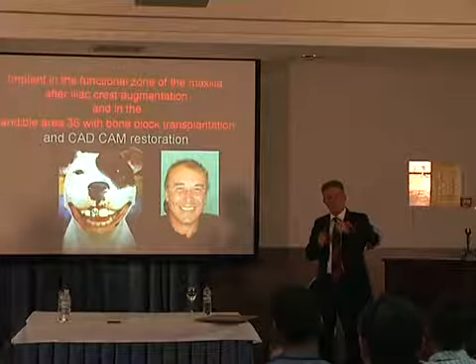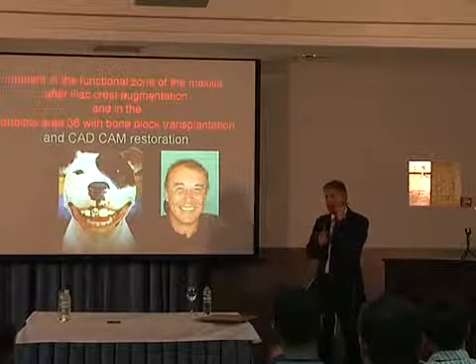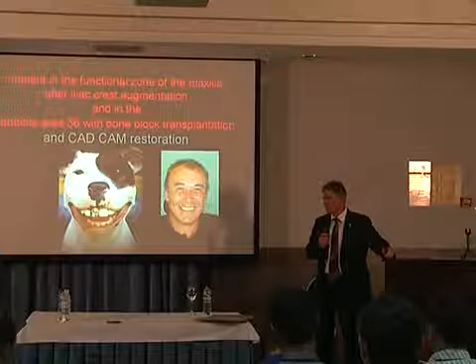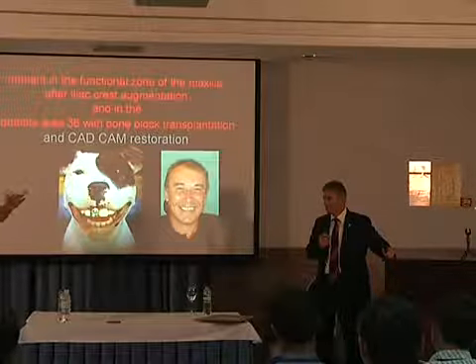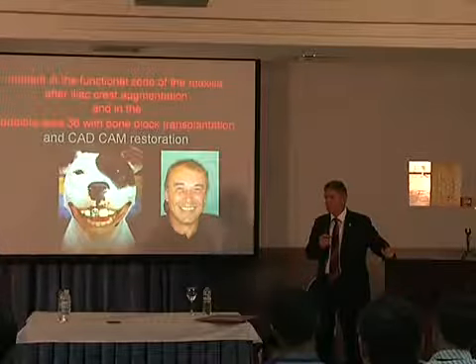Before we check the bone block in the mandible, this patient got some implants in the maxilla with iliac crest augmentation. Перед тем, как мы сейчас будем рассматривать блоки на нижней челюсти, этот же пациент имел подсадку костных блоков, которые были взяты из гребня подвздошной кости.